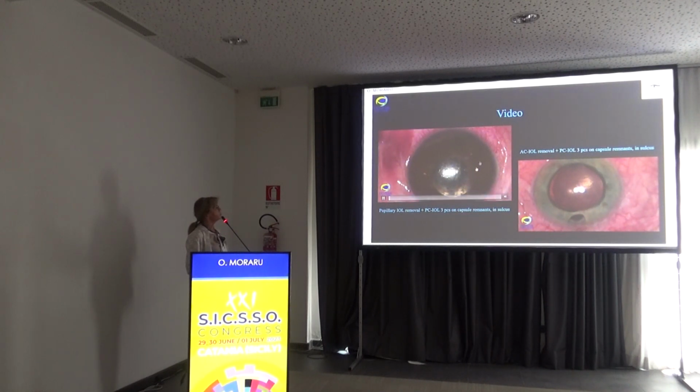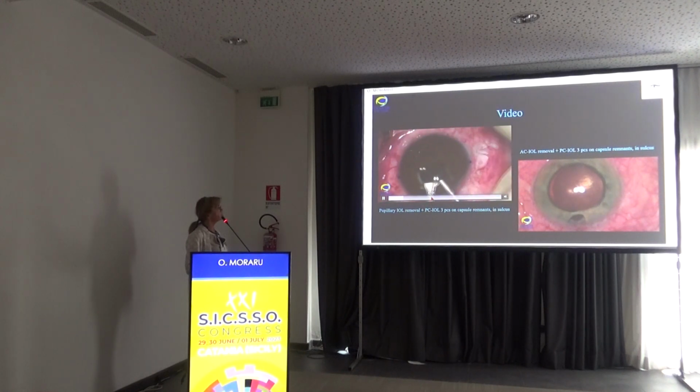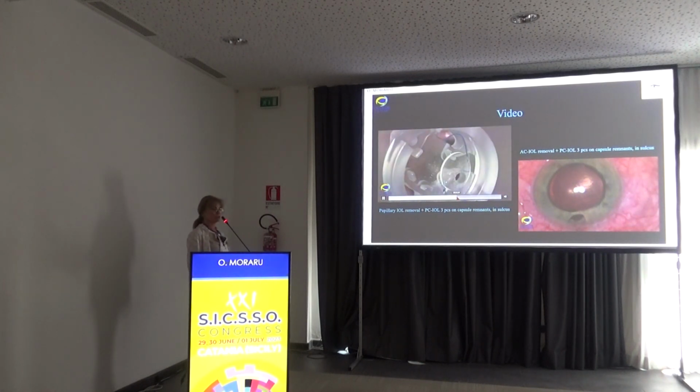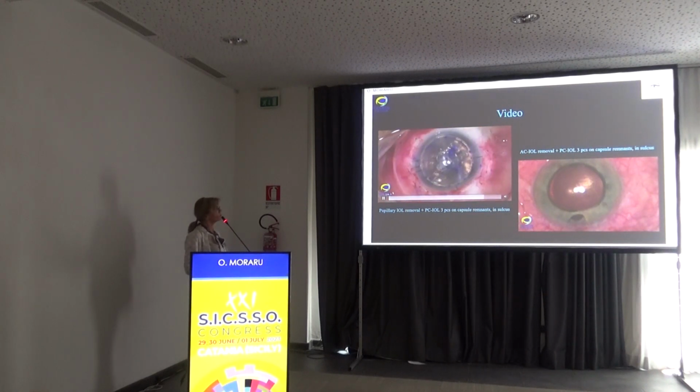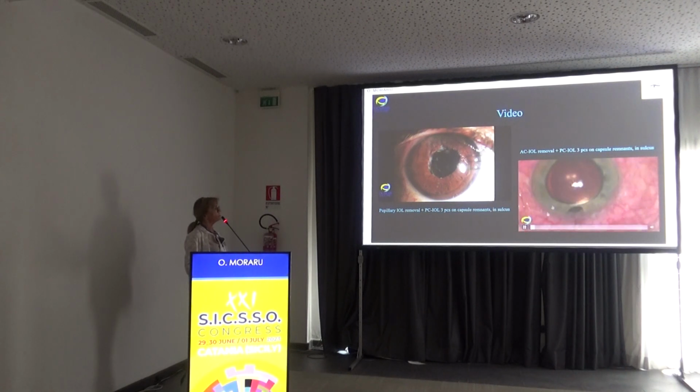I will go even further. Again, you have a Fyodorov IOL, again the same difficulty in explanting it. You have to be careful not to leave any haptics, you don't want to have them on the retina. Because we carefully examined the periphery and saw that there were significant and sufficient capsular remnants, we implanted the 3-piece Alcon IOL on the capsular remnants, and this is what we did.